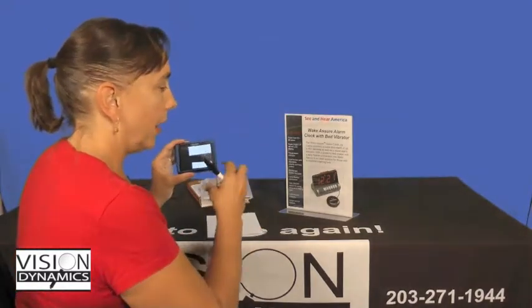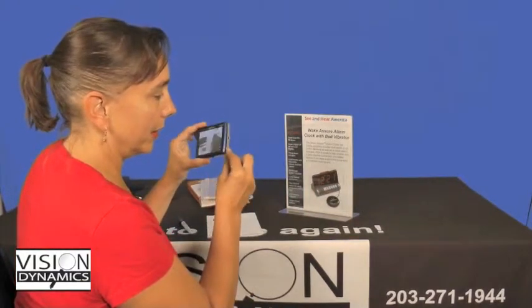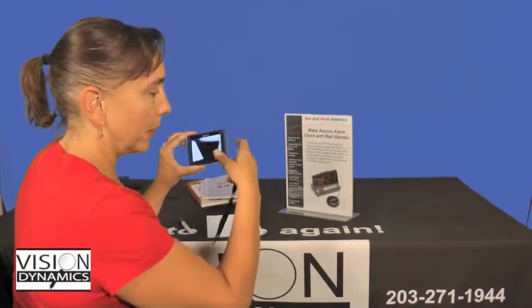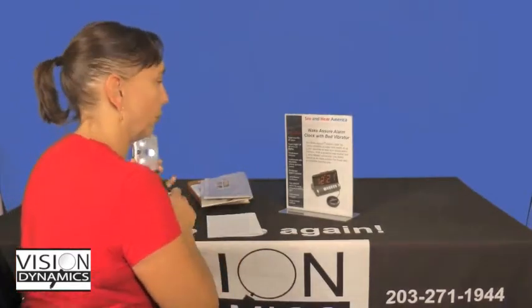Now remember, I have oriented everything to when I'm using it with the on-off button on the right-hand side, your capture button on the top, your toggle switch on the bottom. But if you hold it in your left hand, it still works just fine. It's just going to rearrange the orientation of where the buttons are.